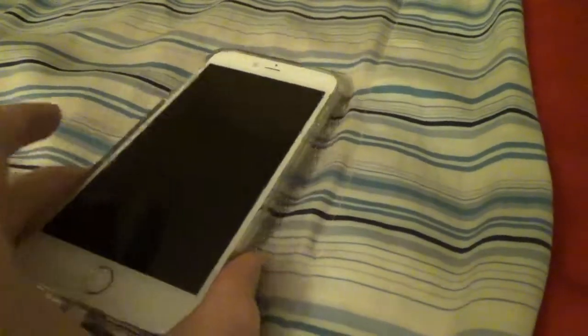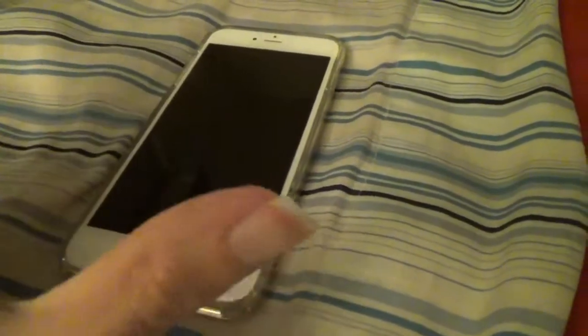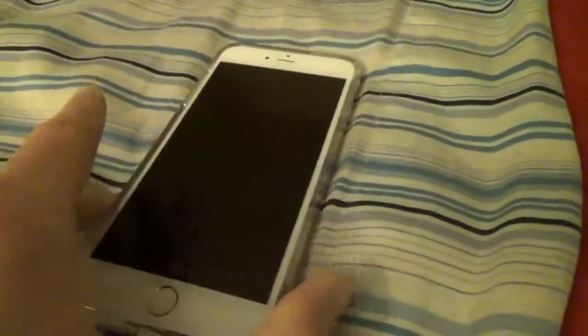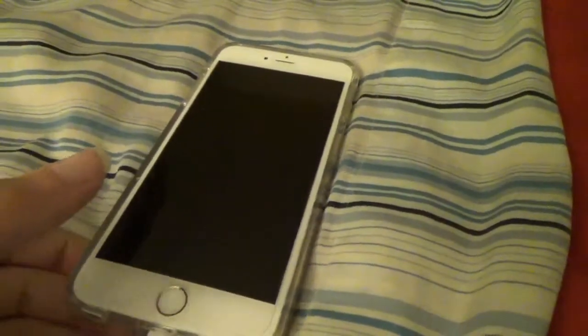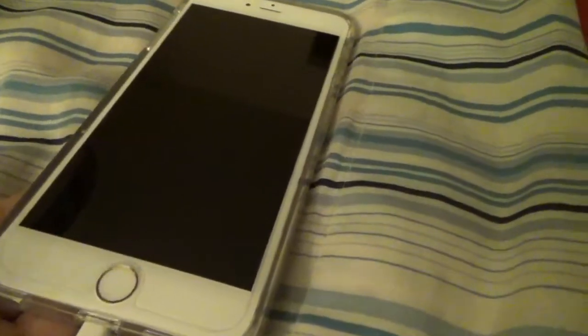And if you're thinking about bang for the buck, a lot of those devices run about the same price, $500, $600, $400 range. Same exact price as the iPhone on contract. The difference is, in addition to the handheld magnifier, a lot of the dedicated video magnifiers only allow you to store maybe half a dozen, maybe a full dozen images at most.